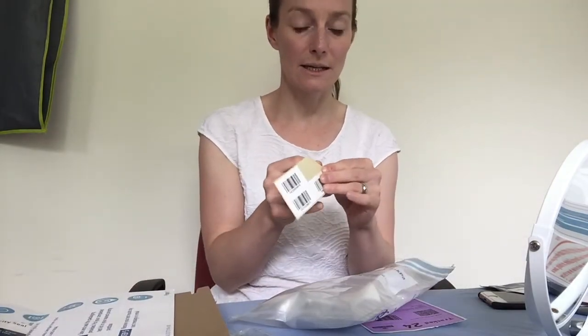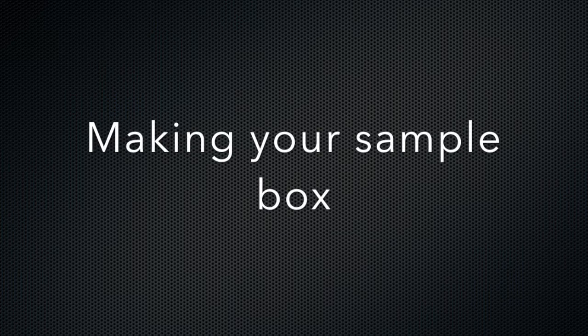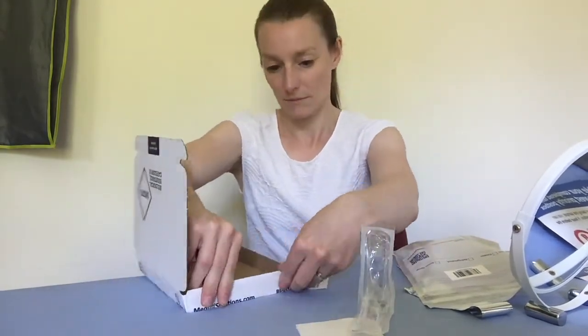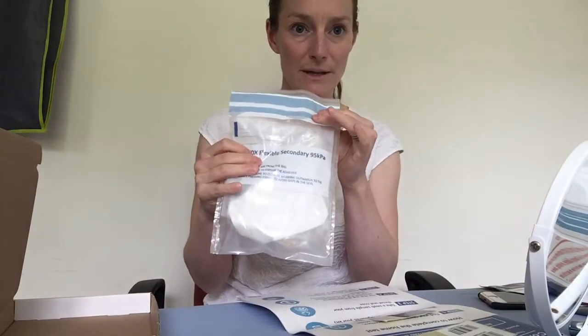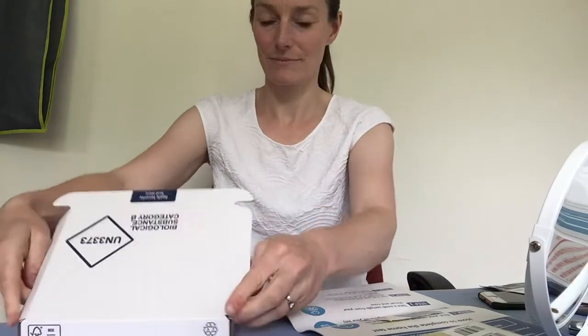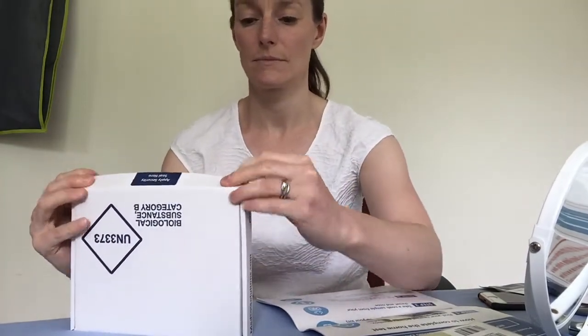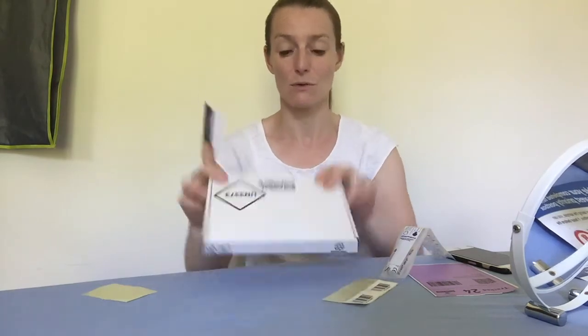The next thing you do is stick a barcode again on the outside of this bag. Then you build your box and put the sealed bag inside the box. After that, you stick the labels on the box and the security seal, which is how they know that nobody's tampered with or touched what's inside.